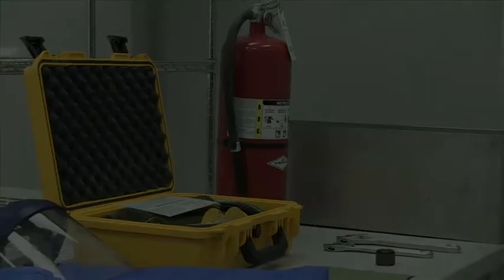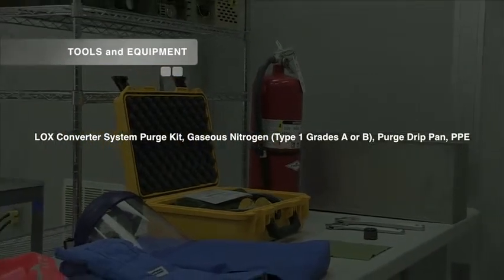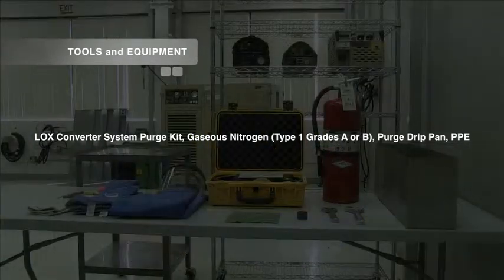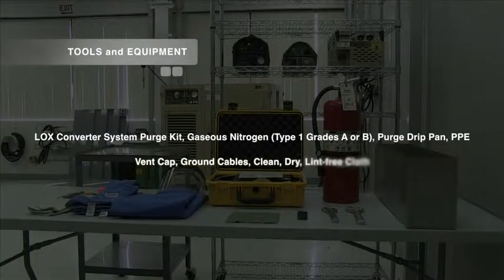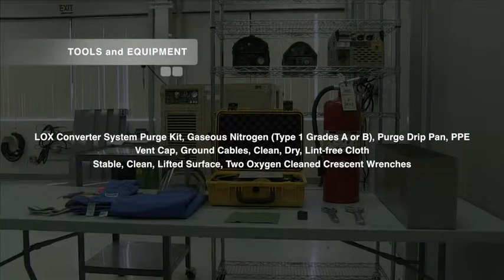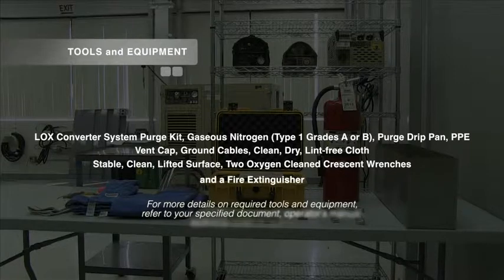To prepare for inspection, filling, draining, and purging of the BMOS and M-MOS, it is a good idea to first gather all the required tools and equipment needed for each procedure. Items needed include a liquid oxygen converter system purge kit, access to a gaseous nitrogen source conforming to type 1 grades A or B, a purge drip pan, PPE, a vent cap, grounding cables, a clean dry lint-free cloth, a stable clean lifted surface such as a counter or table, two oxygen-clean crescent wrenches, and a fire extinguisher. For more details on required tools and equipment, refer to your specified document, operator's manual, technical order, or equivalent.